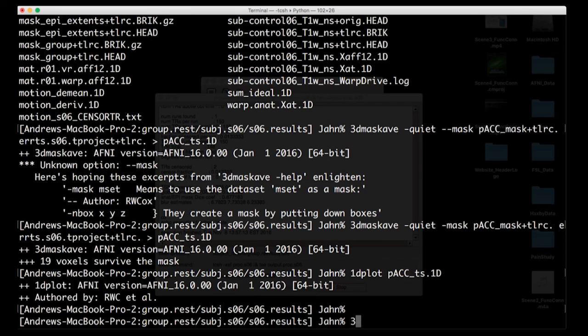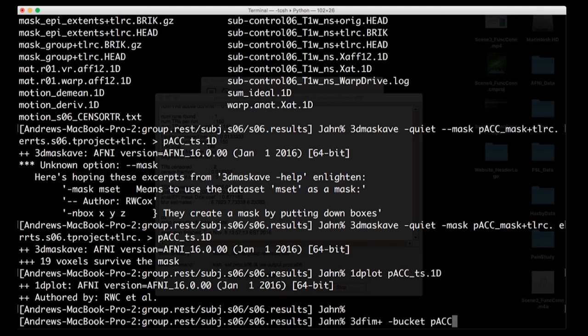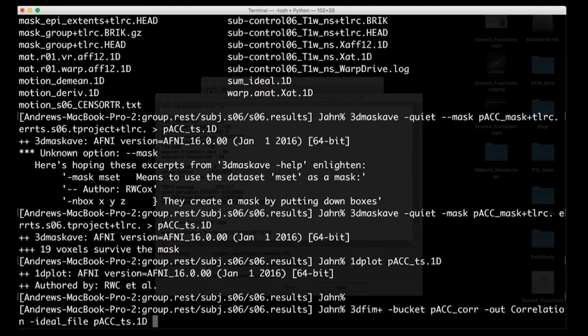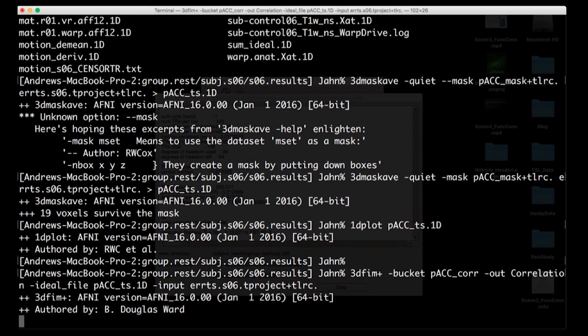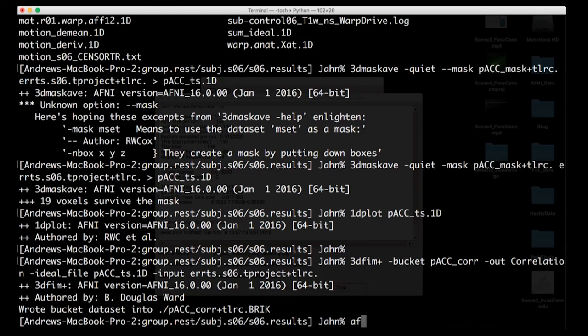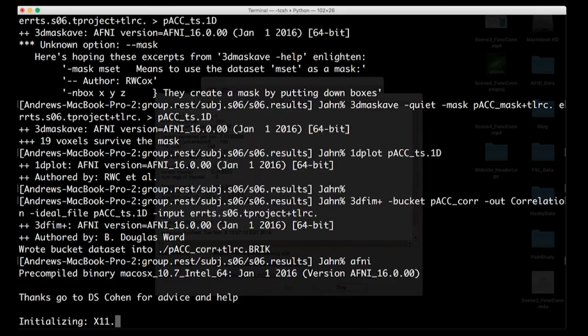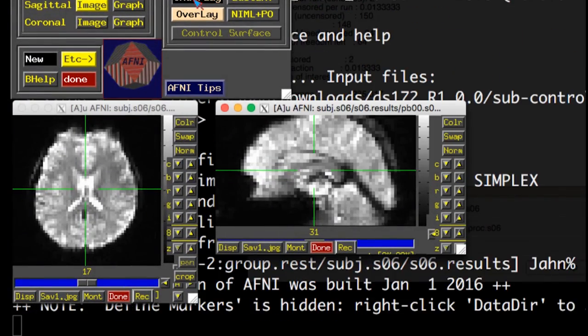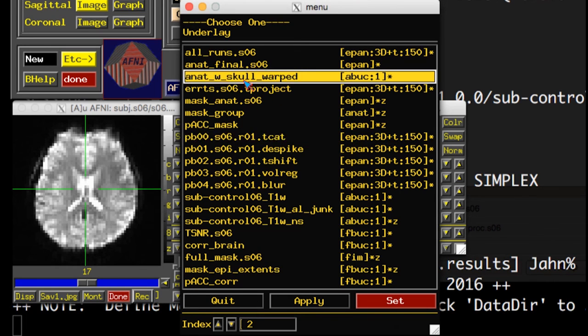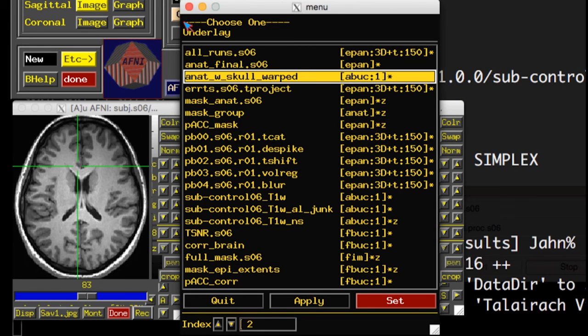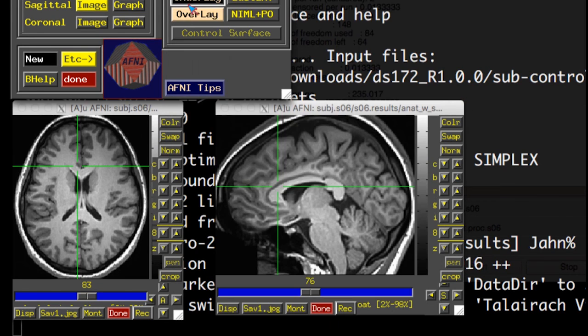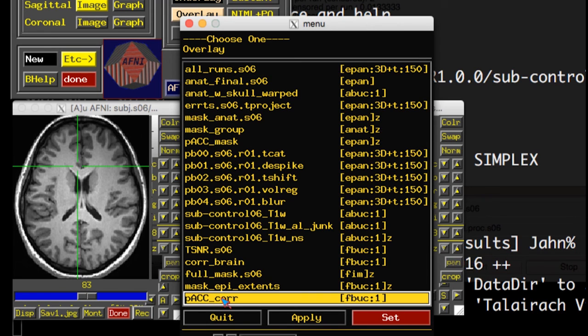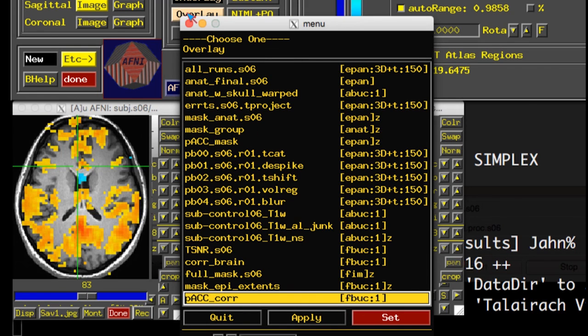So final step here, 3dfim+, again, don't ask me what that stands for. The bucket is like your prefix. It's the name of your output data set. And we're going to output the correlation metric. A few more things, the ideal file. What are we going to do for cross correlation? pACC_ts. And then we're going to give it the input, again, our T projected or de-trended errtime_series. The output from this is going to be pACC_corr.